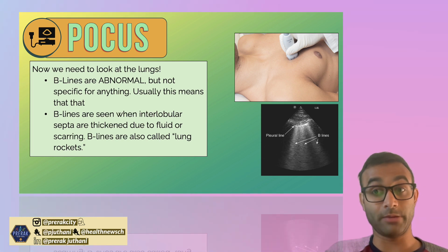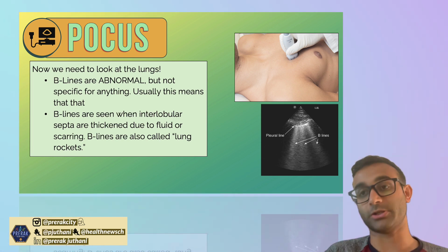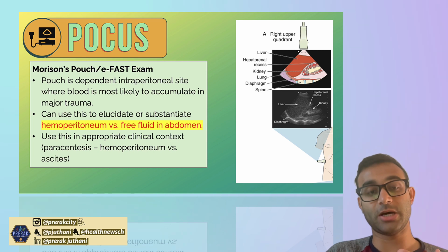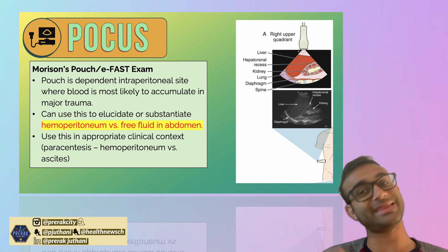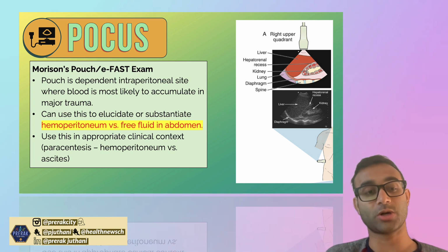We've kind of gone over the abdominal aspect. We've gone over parasternal long, parasternal short, sub-xiphoid. And now you saw just how important it is and how cool it is that we can look at a lot of these organs pretty quickly at the bedside and use them ultimately to work up hypotension.